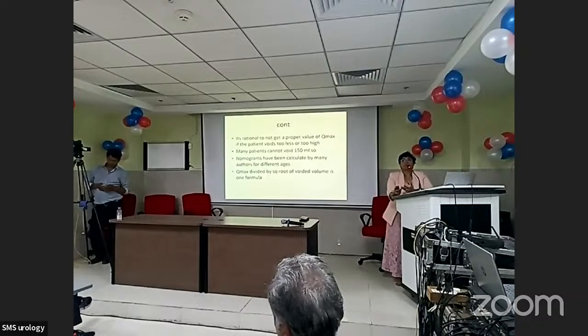So these two things we should keep in mind. You can make a diagnosis of obstruction very easily on the three things I told you. But what are the caveats to it? The caveat is when the patient voids a very small amount of urine or a very large amount of urine.